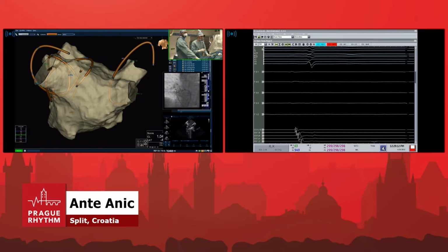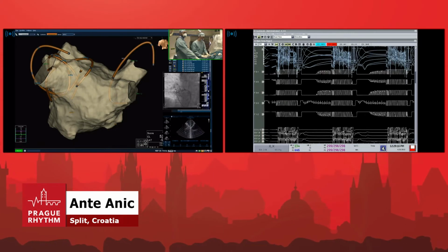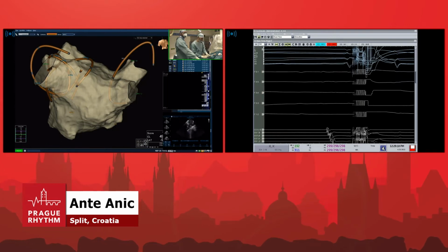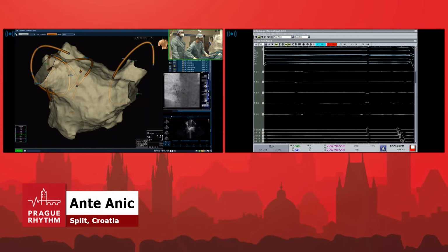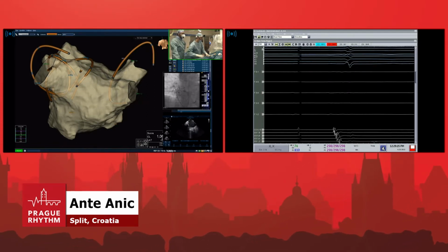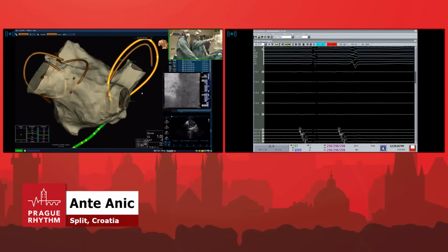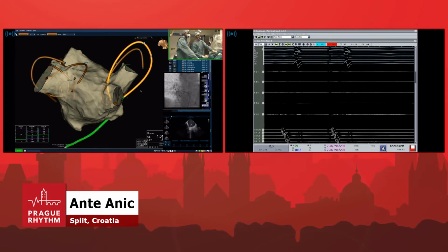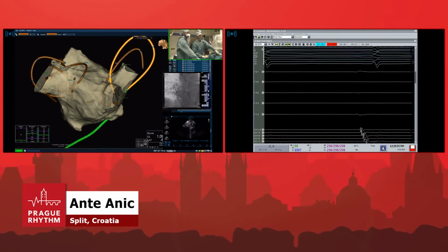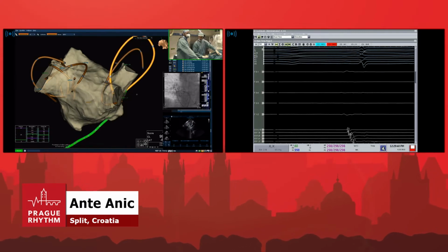This is not anchor. Okay. I'll try and go in a bit. Come back a bit. Okay. How did it look? Oh, it's nice, but I would like a little bit more sheath. Thank you. Let's do this then. How do you like it right now? Sorry, show me the septal part. Oh yeah. Okay, let's go. Right inferior PV, pulse 5.